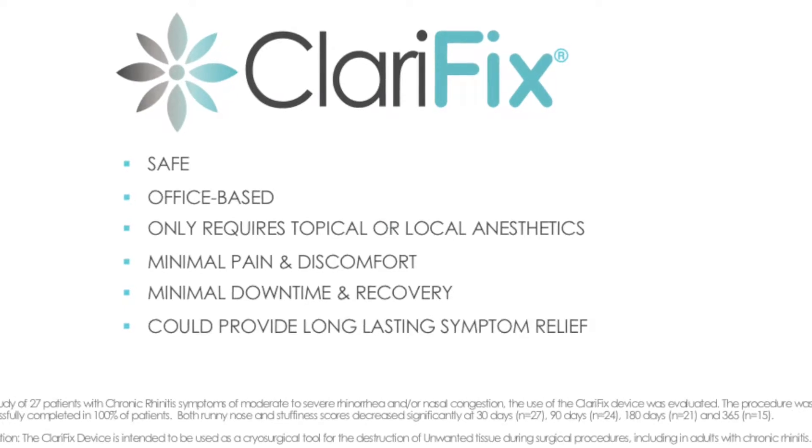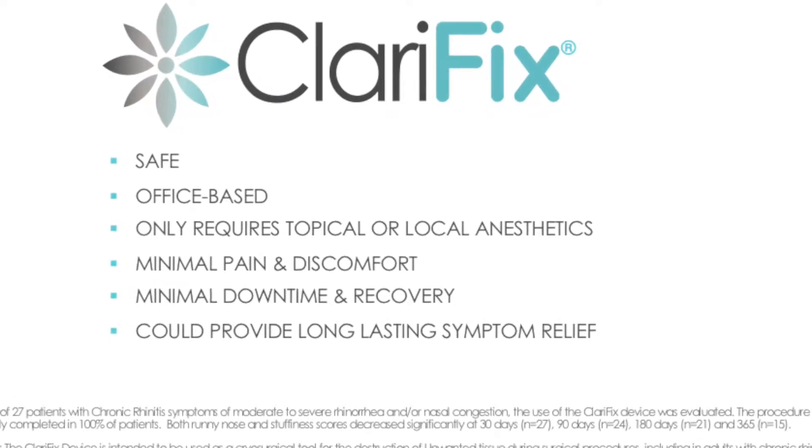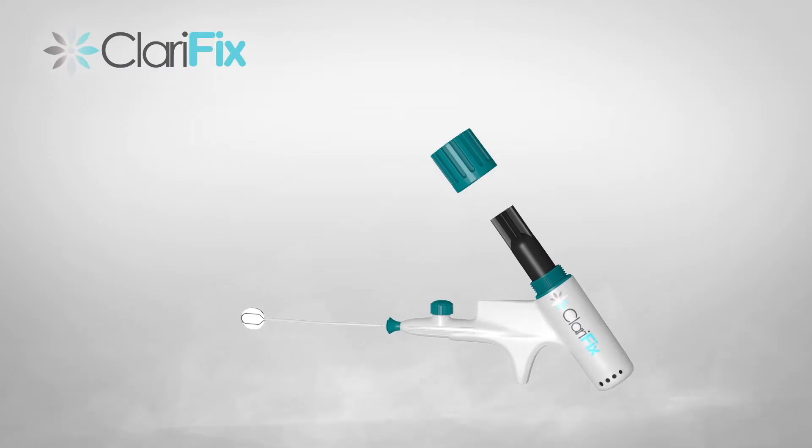In a clinical study, patients reported durable relief with minimal pain and discomfort. The Clarifix device is comprised of a handpiece and cryogen canisters.